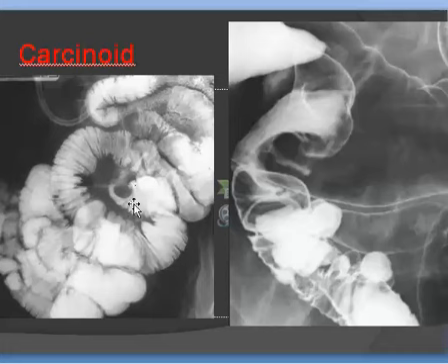Filling defects, a mass along the lumen, should be investigated as a carcinoid so long as there are clinical symptoms and signs of carcinoid syndrome, because a small intestinal carcinoid is usually associated with carcinoid syndrome, which comprises flushing, diarrhea, and sometimes hypertension.